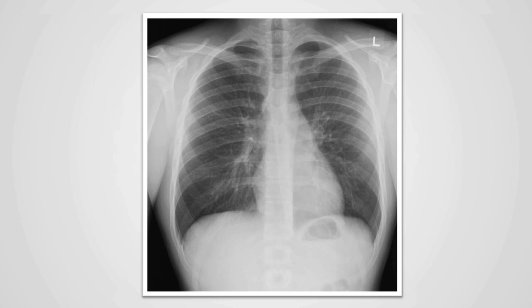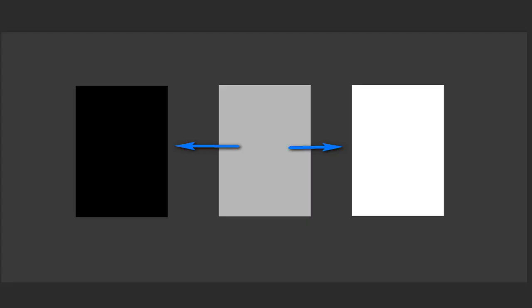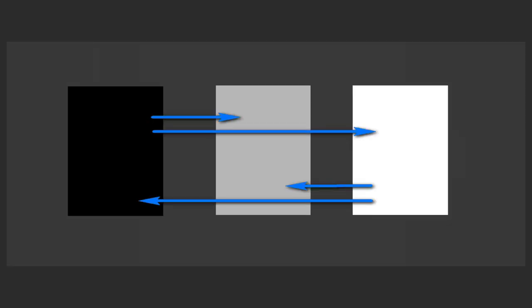When pathology occurs in the thorax, it causes the normal gray scale of the chest x-ray to change in several ways. A normal gray structure can become too black or too white, or a normally black structure can become gray or too white, or a normally white structure can become gray or too black.